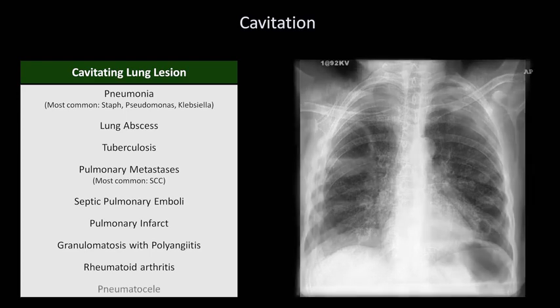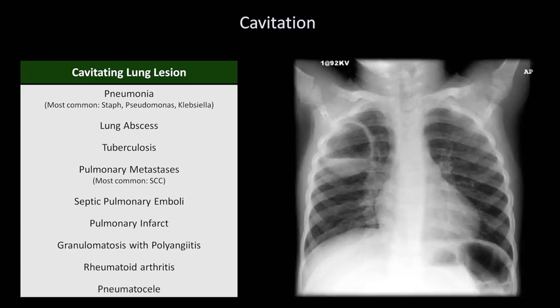And finally, a pneumatocele should be considered, particularly when the nodule or mass is thin-walled and occurs in the aftermath of an acute pneumonia. Patients at this stage can be surprisingly asymptomatic, and pneumatoceles usually resolve over time, provided that appropriate antibiotic treatment for the pneumonia was provided.